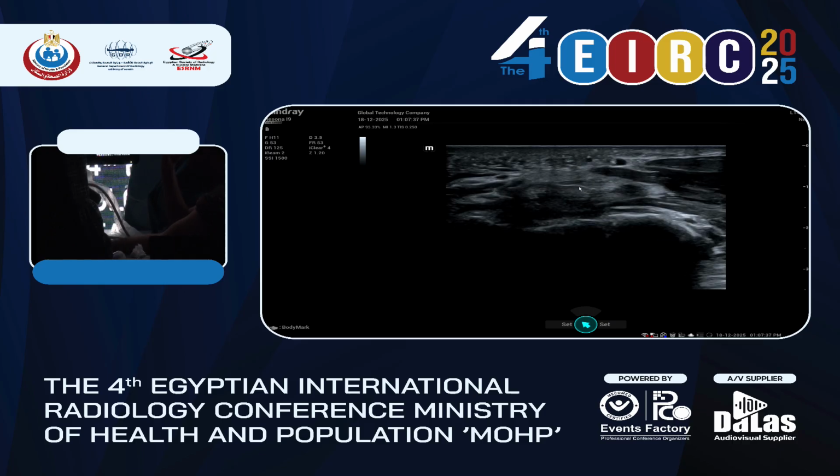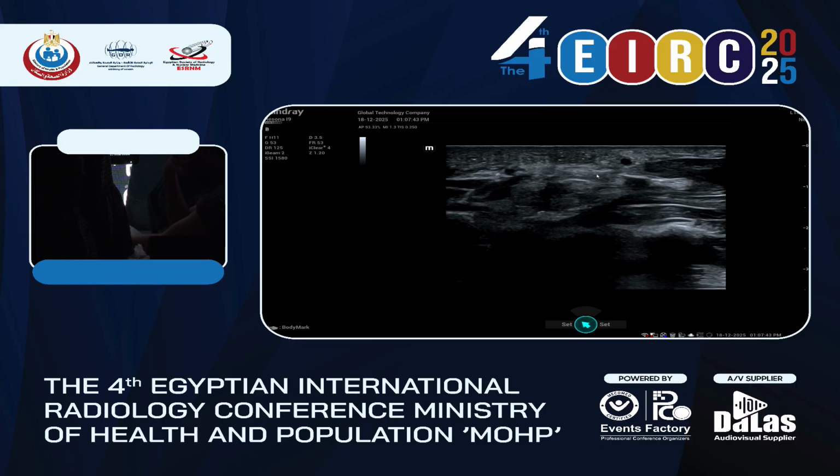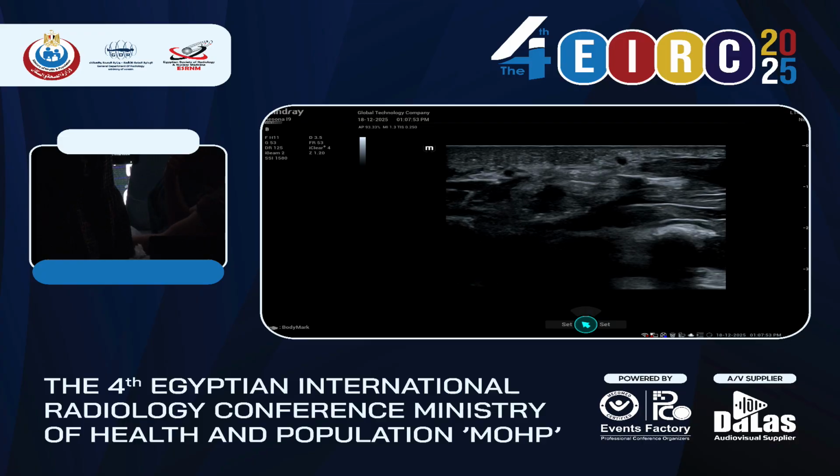And at the exit of the tunnel, here, where the nerve becomes very flat and gives the branches and gives the motor branch, if we see here a very hypoechoic and huge nerve and a big motor branch, that means that the pressure is throughout the carpal tunnel. All the transverse ligament is pressing the nerve. We have to write it down in the report to make sure that the surgeon realizes that they have to operate and cut all the length of the transverse ligament.